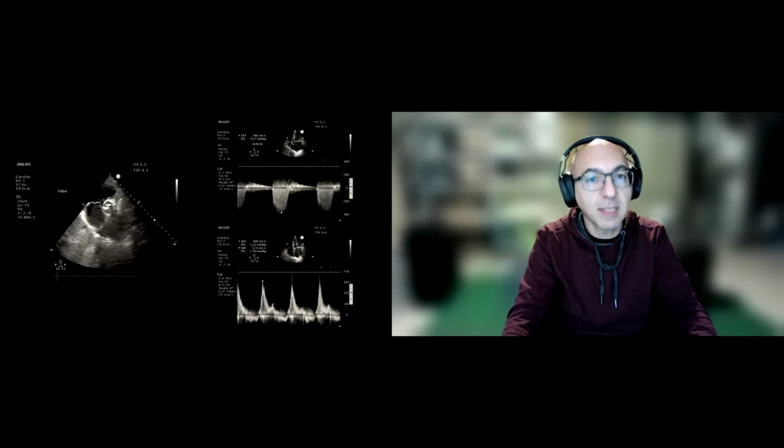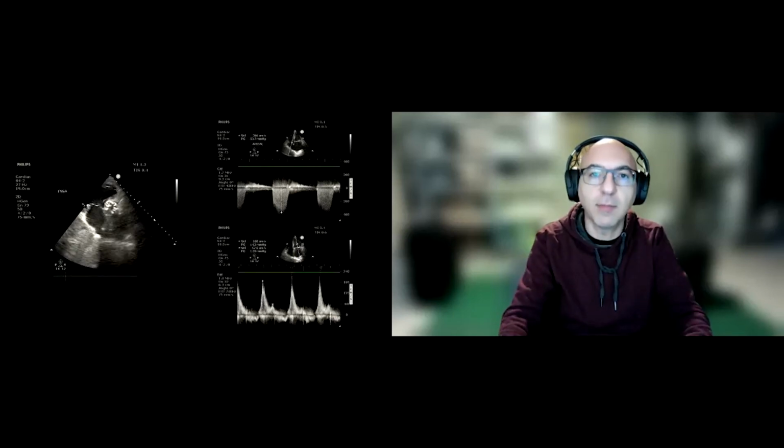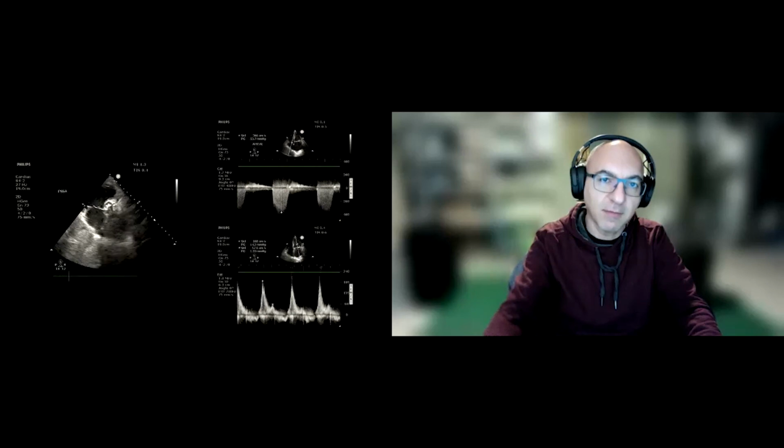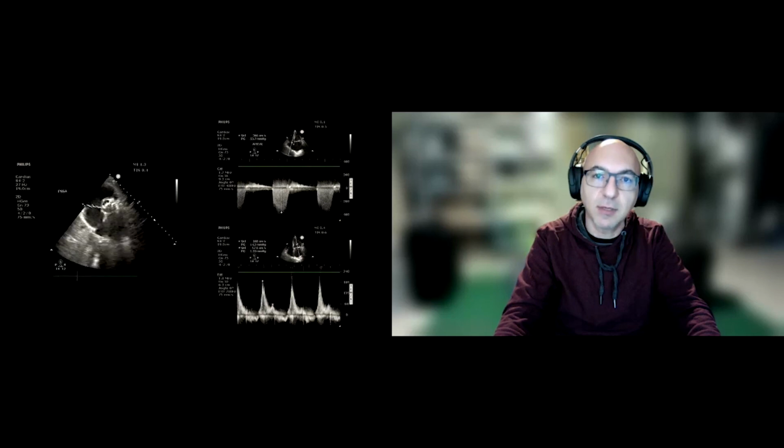But if the lung is stiff, most of it is going to go there. Some people would say all of it. It's never zero or all, but let's imagine someone is intubated on a PEEP of 10, and I reduce their filling load by 10. That might be severely detrimental to the cardiac output, especially with diastolic dysfunction and aortic stenosis.